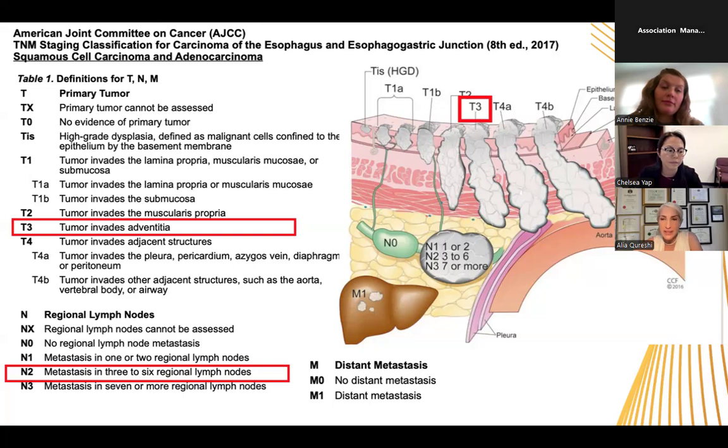You basically take the short gastrics and the left gastric. When you do that, just like traffic, you increase the right gastroepiploic blood supply. The timing is at least 2 weeks apart from your esophagectomy. But I see pretty dramatic responses, and there has been some data that suggests it lowers your leak rate because of better perfusion. That's gastric preconditioning.